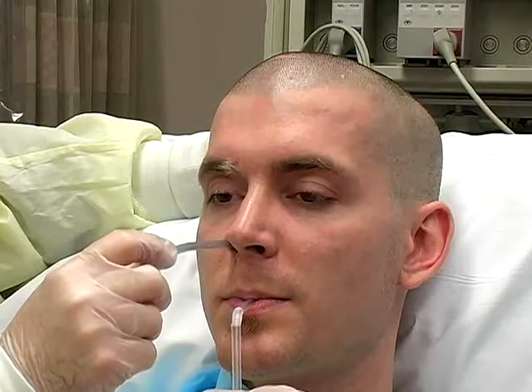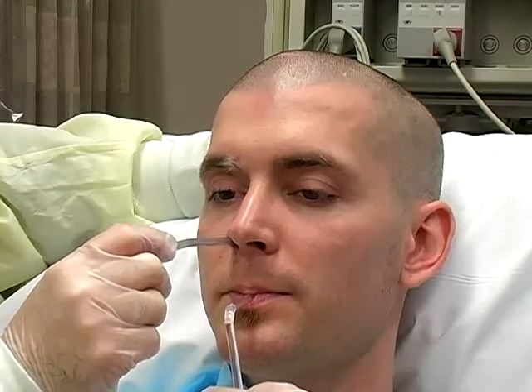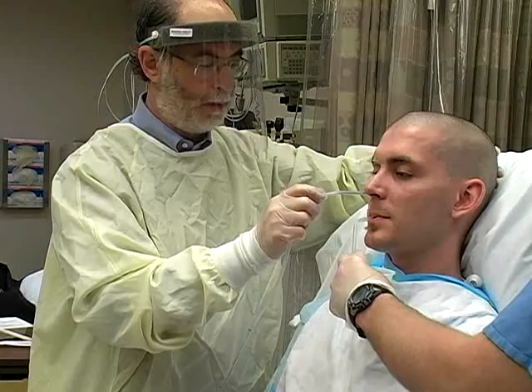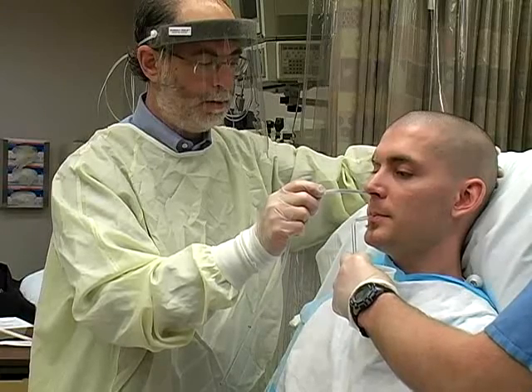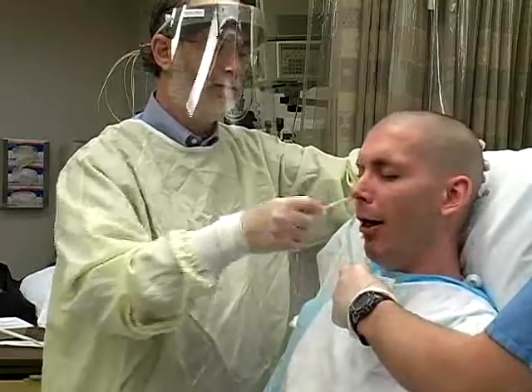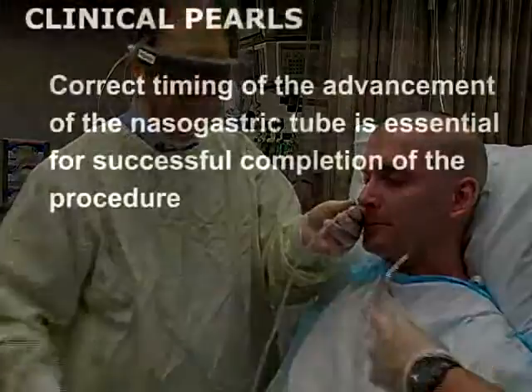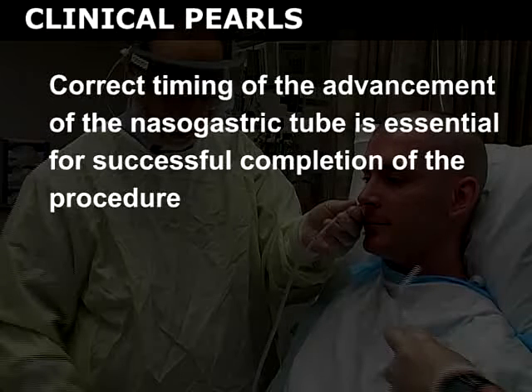Instruct the patient to begin to sip and swallow the water, and carefully coordinate advancement of the tube with the beginning of the swallowing mechanism. Rapidly insert the tube into the esophagus and stomach as the patient swallows to the predetermined depth. Correct timing of the advancement of the nasogastric tube is essential for successful completion of the procedure.